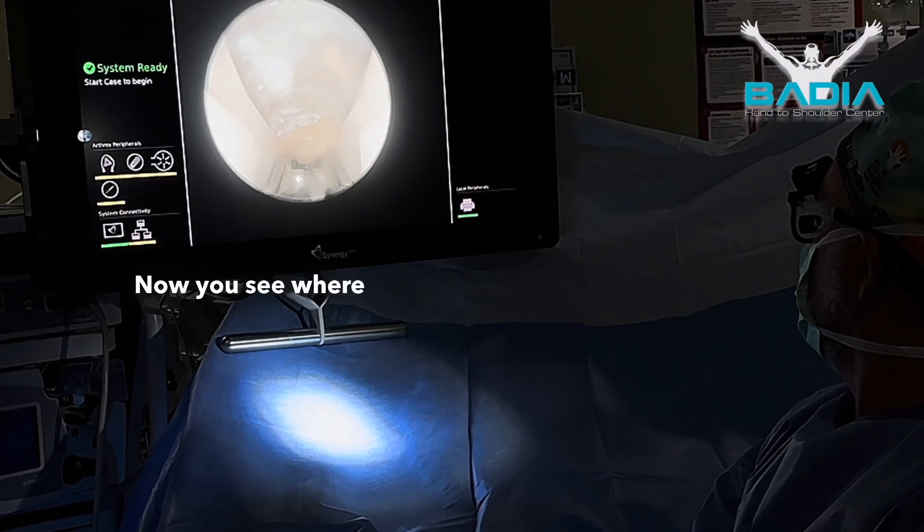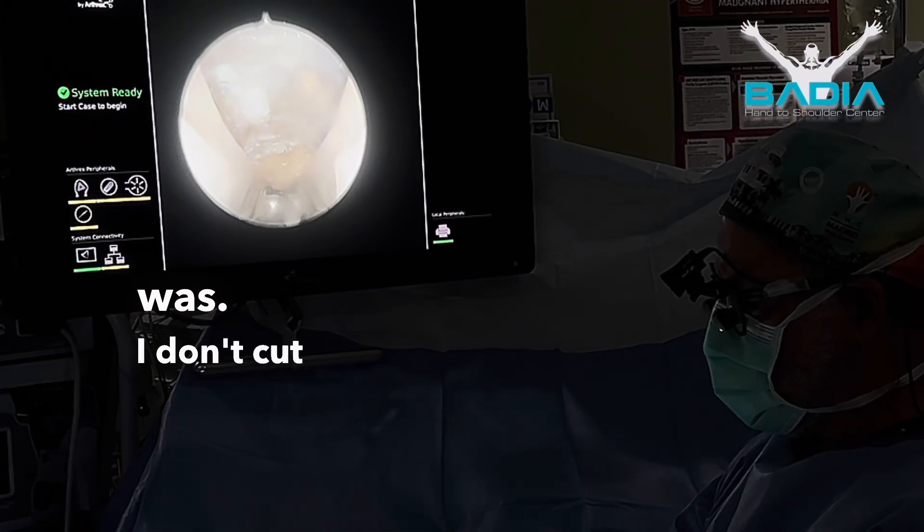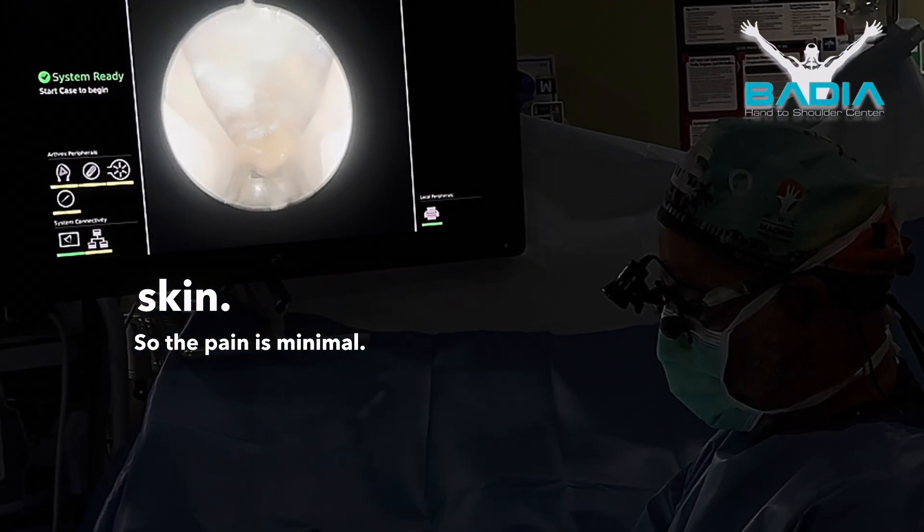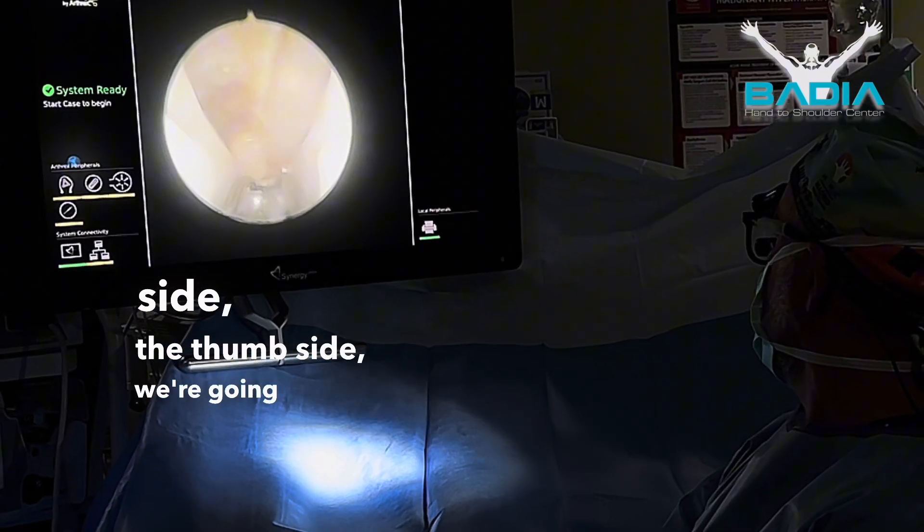Release that a little bit. Now you see where the ligament was. I don't cut the palmar fascia, I don't cut the fat, I don't cut the skin — so the pain is minimum. On the radial side, the thumb side, we're going to look, and there's the median nerve.